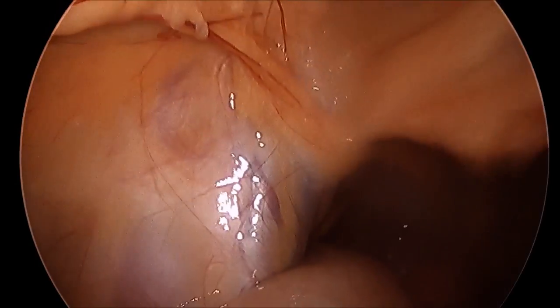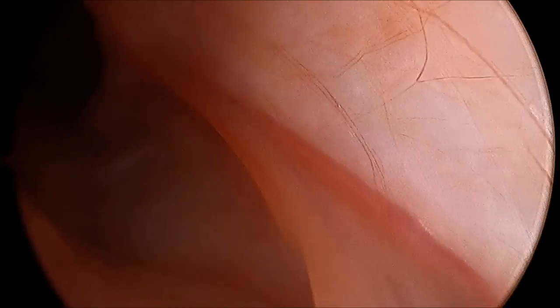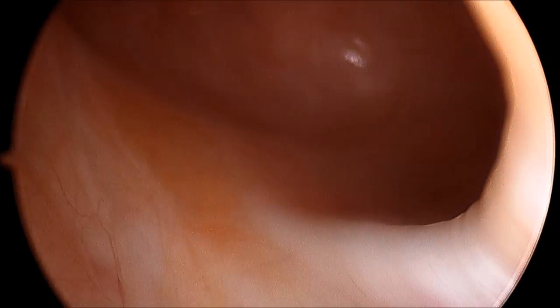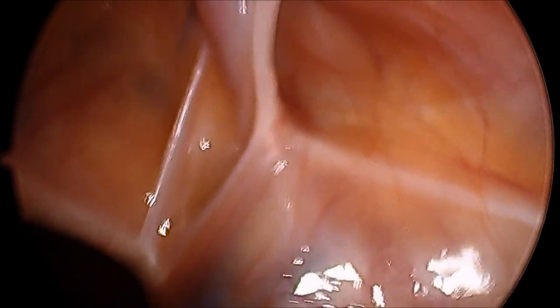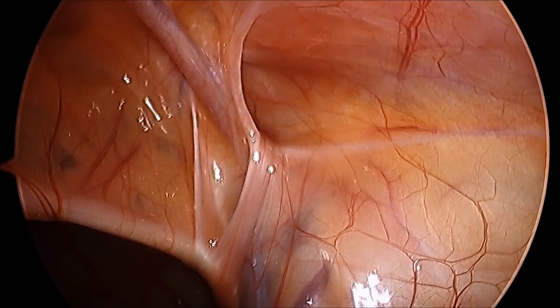This is the left side where there is no hernia, and there is the hernia on the right side. Here the hernia can be seen from the outside. The location of the internal inguinal ring is marked.